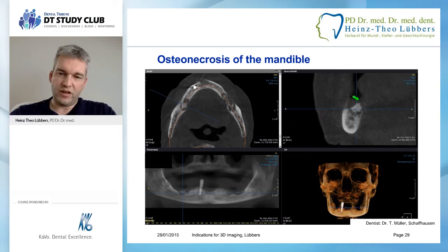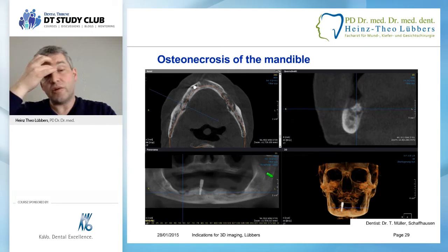So you always see more problems and more sequestrum and more dead bone in the 3D imaging. That's pretty much a constant situation. So prior to surgery or to evaluate even these class 0 levels of ONJ, you need 3D imaging also.